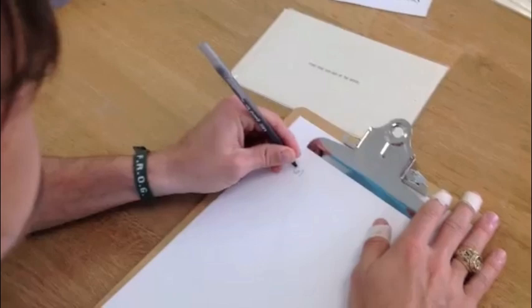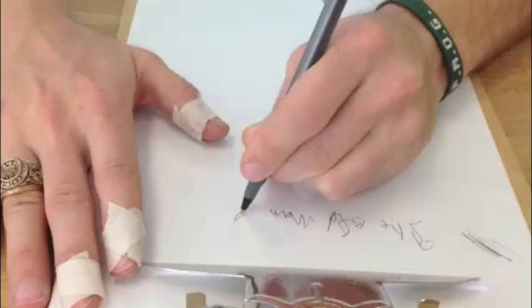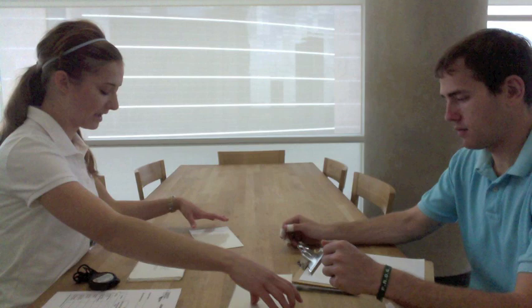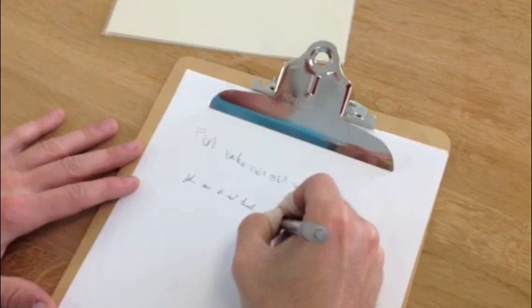The therapist confirms understanding, says 'Ready?' and 'Go.' After the left-hand writing task is completed, she instructs: 'Now repeat the same thing, only this time use your right hand. I'll give you a different sentence.' After the patient completes the right-hand writing, she says 'Great' and moves on to the next part.